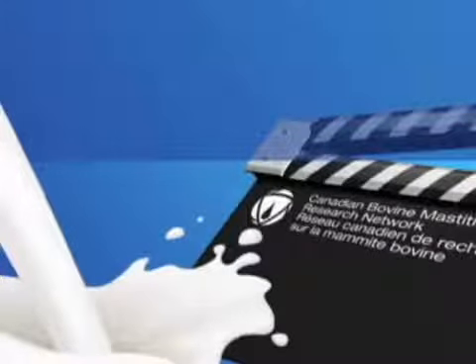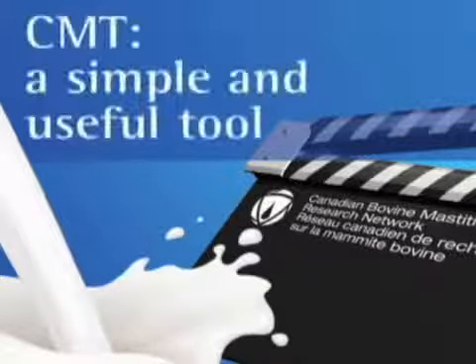The Canadian Bovine Mastitis Research Network presents CMT, a simple and useful tool.